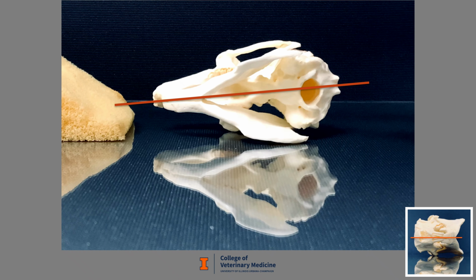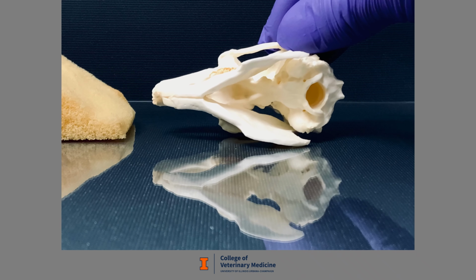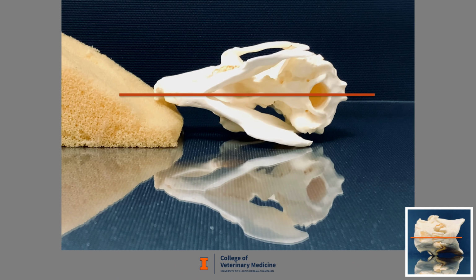In the lateral position, the sagittal plane of the rabbit skull naturally tilts down rostrally due to the narrowing of the mandible and maxillary bones. To maintain the sagittal plane of the skull horizontally to the radiograph plate and generator, a small wedge is placed under the nose. The mandibular rami are positioned so that they are completely overlying each other.